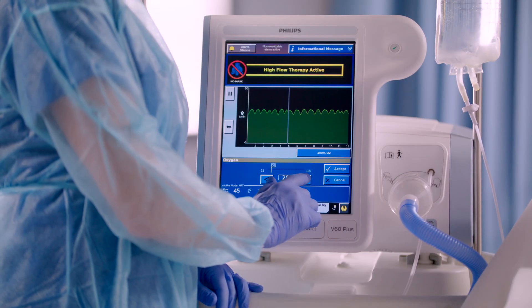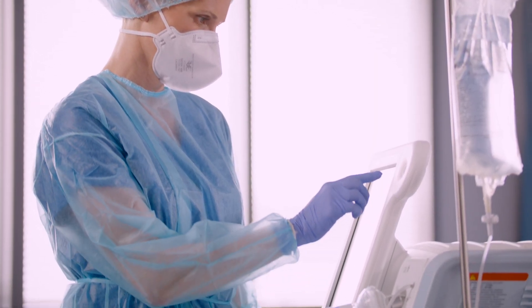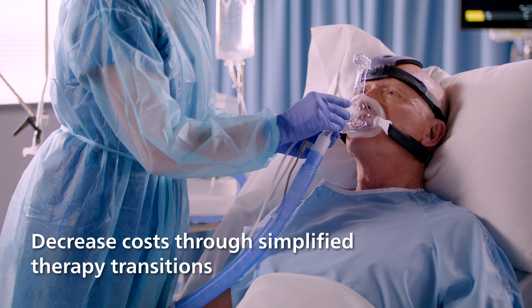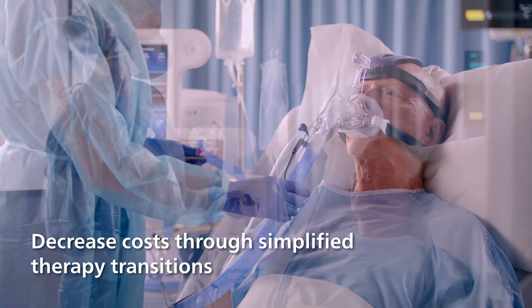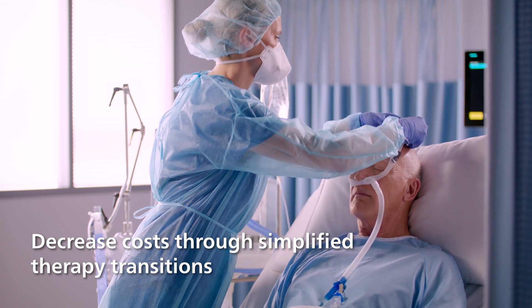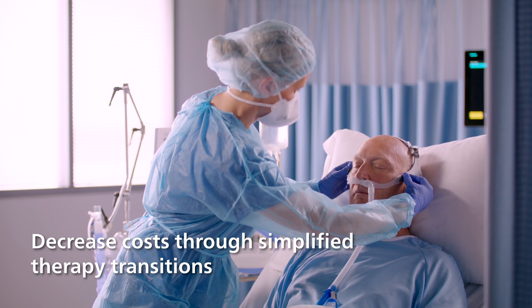This provides comfortable flow delivery and can use the same circuit as our NIV masks. Because the same circuit can be used for both the AC611 and your NIV mask, it may decrease overall setup costs, simplify workflow, and save time when switching between therapies.